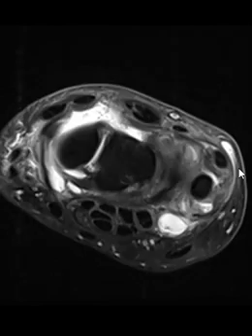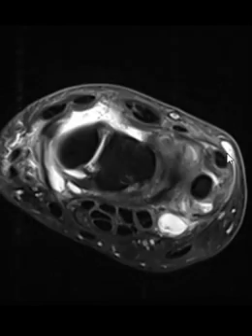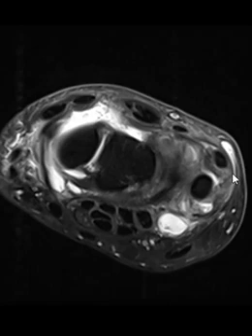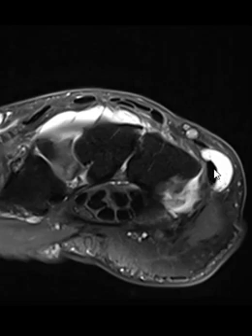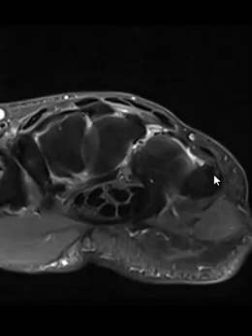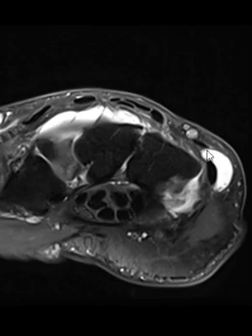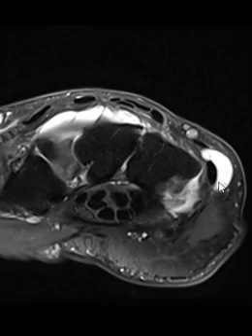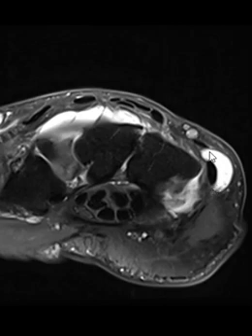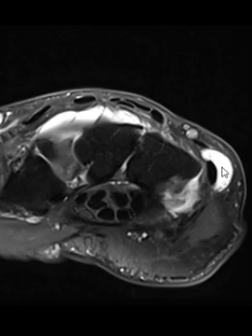Going more distal, we see this little fluid collection — a little bit of contrast which is superficial. This is extravasated through the ulnar joint capsule. Continuing more distally, we get to the attachment at the base of the fifth. Coming proximal, we see this contrast collection around it. This is what the patient was feeling — the fluid that had gone into the distal ulnar region surrounding that ECU tendon here distally.